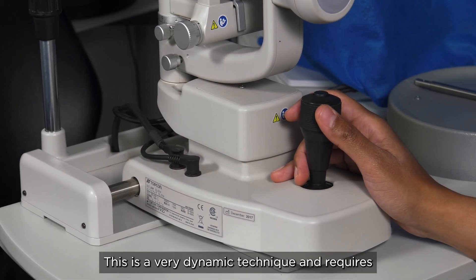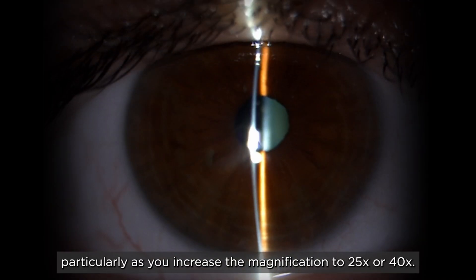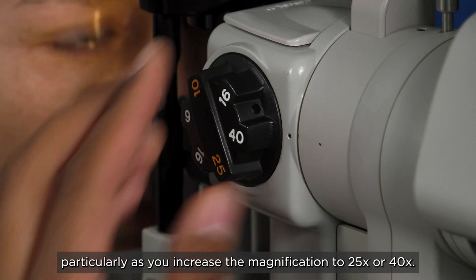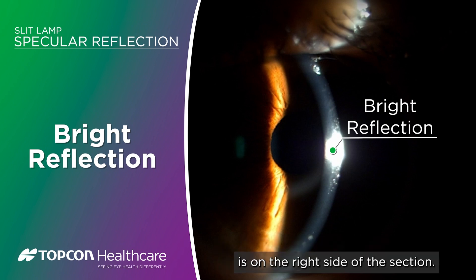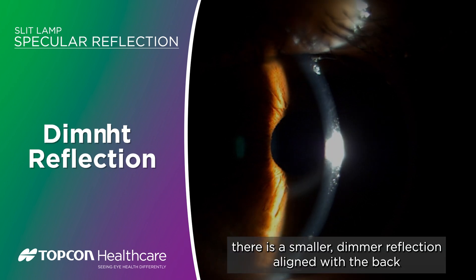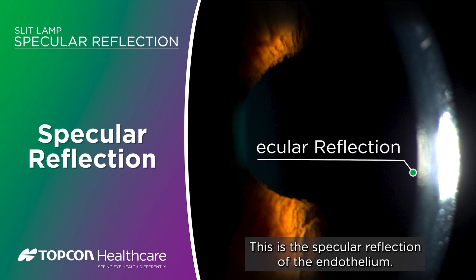This is a very dynamic technique and requires constant adjustments of the joystick to keep the bright reflection in view, particularly as you increase the magnification to 25 or 40 times. With the light beam coming from the right side, the bright reflection from the tear film or epithelium is on the right side of the section. If you look carefully to the left of the bright reflection, there is a smaller, dimmer reflection aligned with the back surface of the cornea.